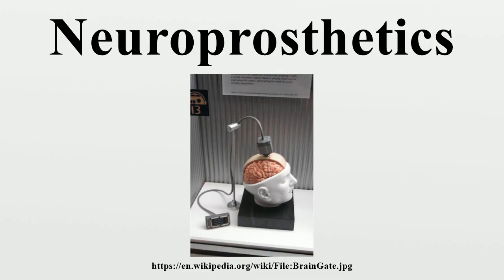In 1988, the lumbar anterior root implant and functional electrical stimulation facilitated standing and walking, respectively, for a group of paraplegics. Regarding the development of electrodes implanted in the brain, an early difficulty was reliably locating the electrodes. Originally done by inserting the electrodes with needles and breaking off the needles at the desired depth. Recent systems utilize more advanced probes, such as those used in deep brain stimulation to alleviate the symptoms of Parkinson's disease. The problem with either approach is that the brain floats free in the skull while the probe does not, and relatively minor impacts, such as a low-speed car accident, are potentially damaging.